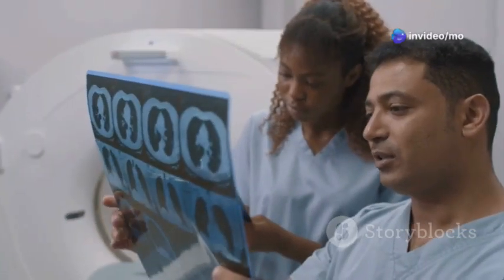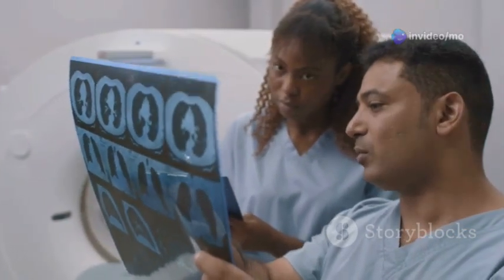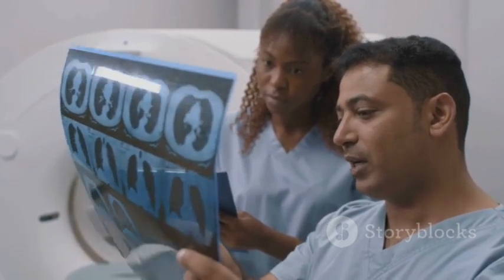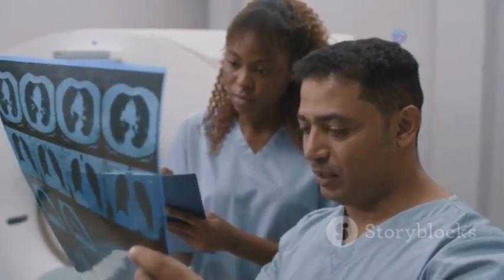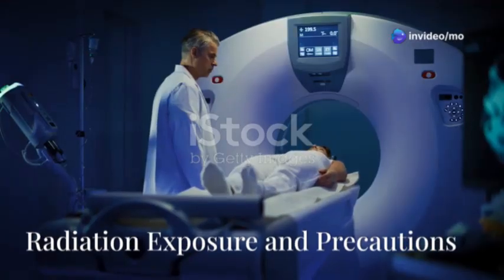By analyzing the Hounsfield unit values of different structures in a CT scan image, radiologists can accurately characterize tissues, identify abnormalities, and make informed diagnoses.